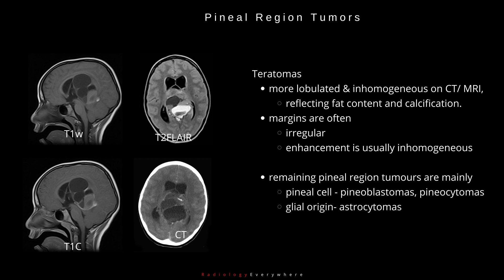Teratomas appear more lobulated and inhomogeneous on CT and MRI, reflecting fat content and calcification. The margins are often irregular, and enhancement is usually inhomogeneous.